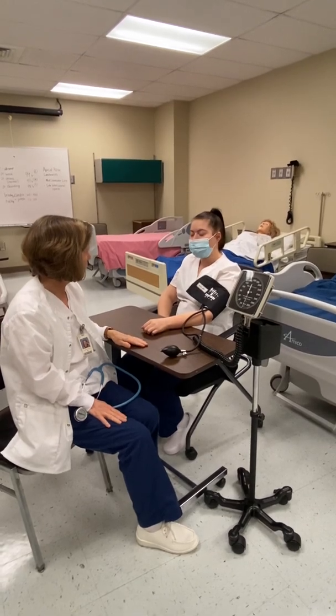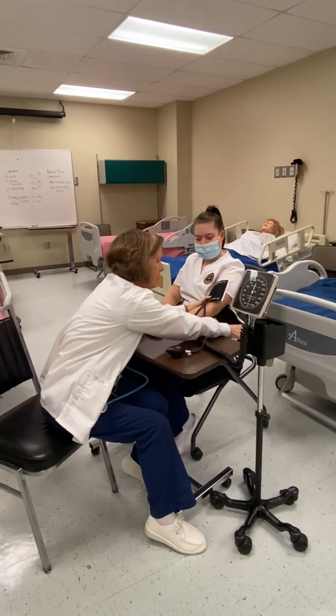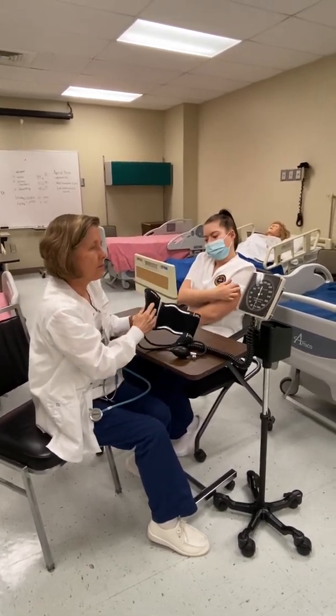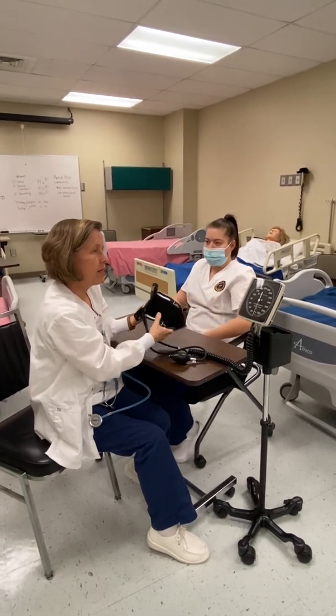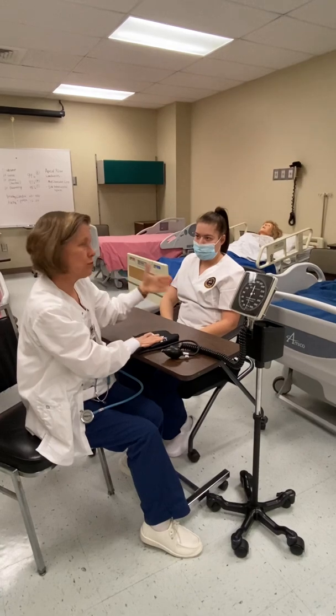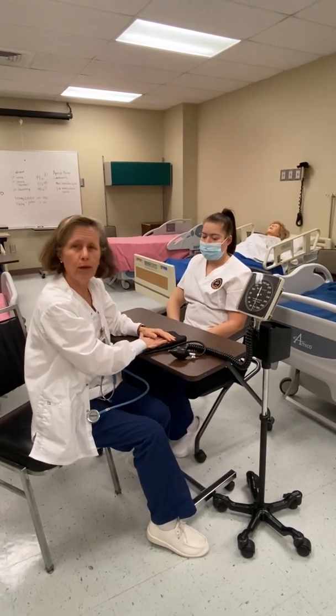Is that about normal for you? Okay, very good. Sometimes you can ask the patient and they have an idea of what their pressure is, and sometimes they really don't know. But doing the two-step gives you a more accurate reading and keeps you from traumatizing the arm by pumping it up too high. I hope that helps.